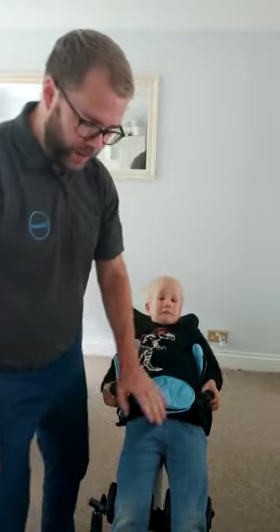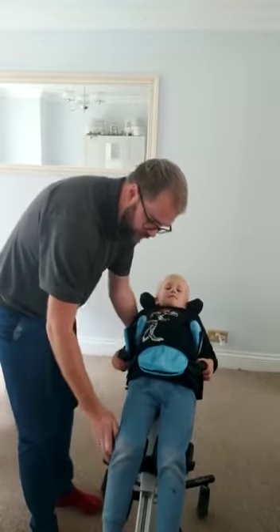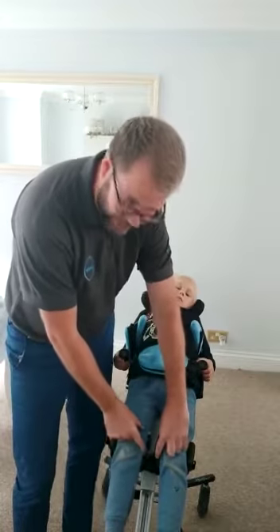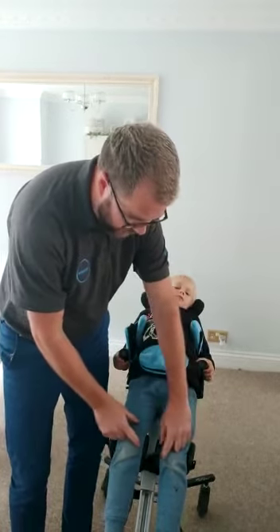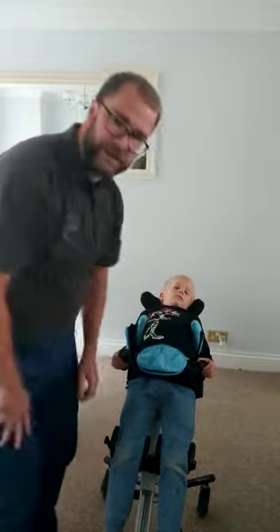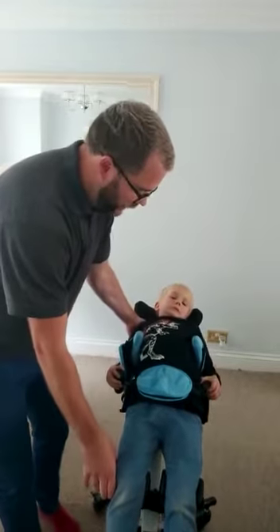Once you've got that one, I like to go down to the knees. As you can see on mine, I have got the knee straps. You would have two blue knee straps that come over here and you'll click those in to the side — again nice and tight. Then go down to the feet and just strap those in with the sandals that you have.